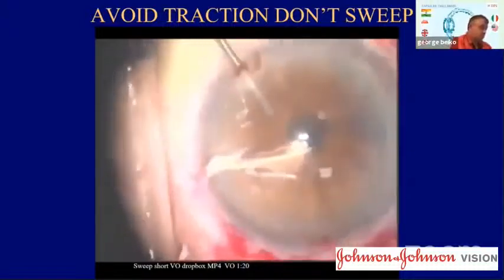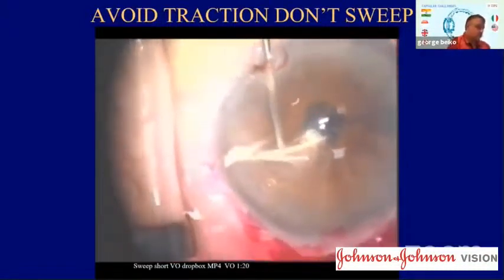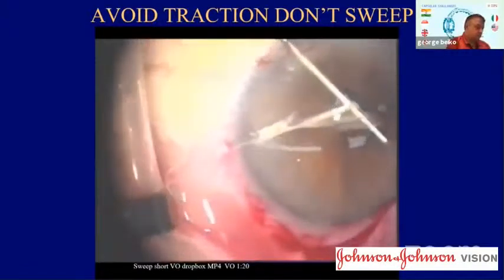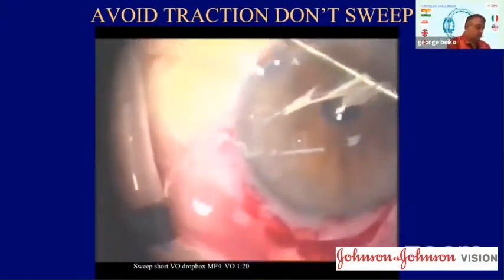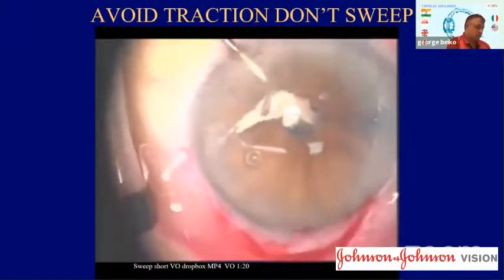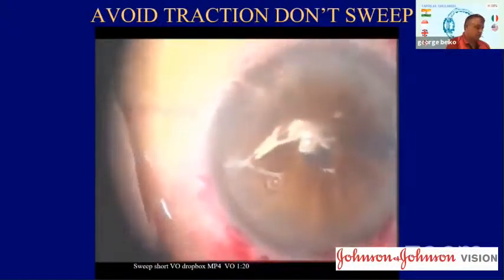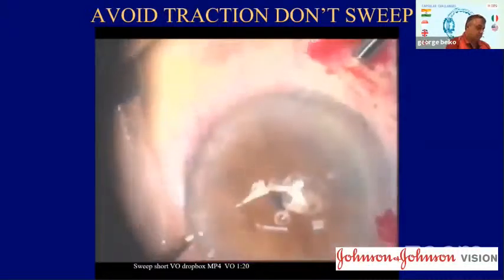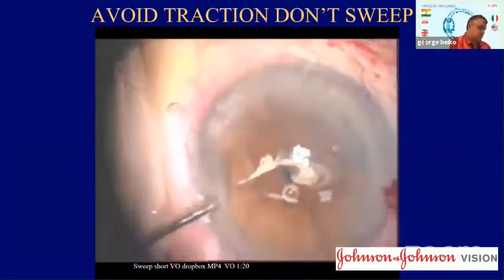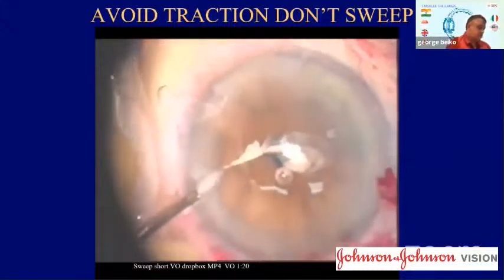However, you can very visibly see why we don't recommend sweeping the incision any longer, because you can see the tremendous tractional forces that are occurring through the pupil with this maneuver. We've made a pars plana incision, and we've inserted our bare vitrector needle through that incision, and we're now placing a 23-gauge irrigating cannula through the paracentesis.